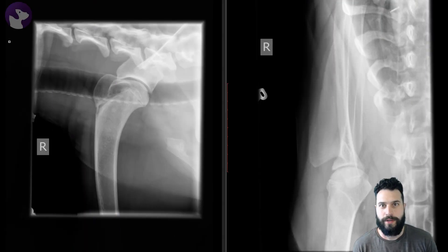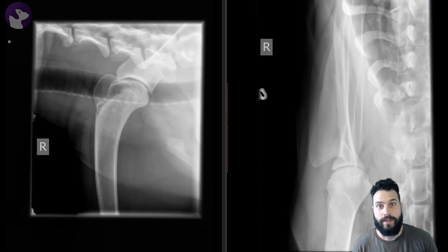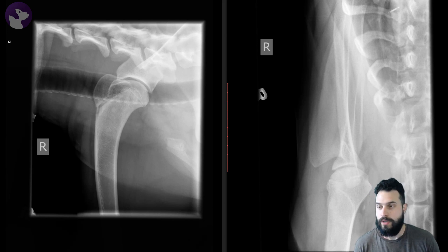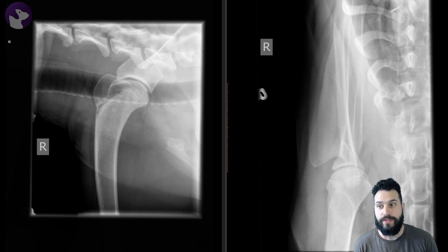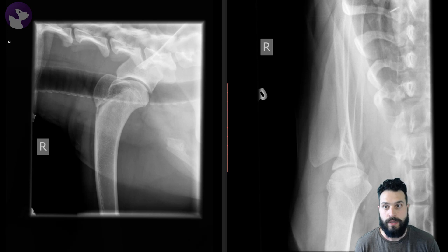Welcome back to the reading room. We all know that case: the young dog that presents lame to our practice and we try to figure out what's going on. This is an example of that — a one-year-old mixed breed dog presenting for lameness of the right thoracic limb.